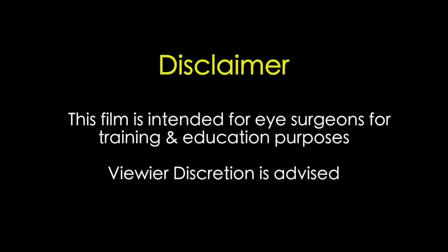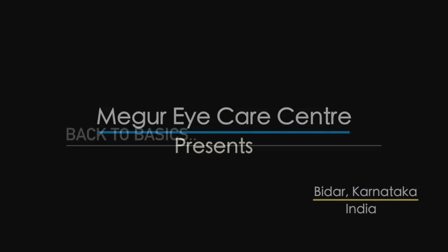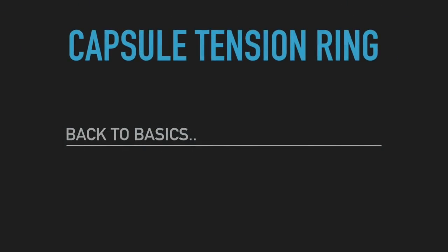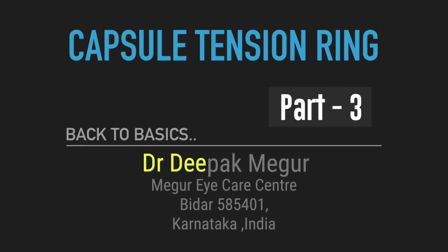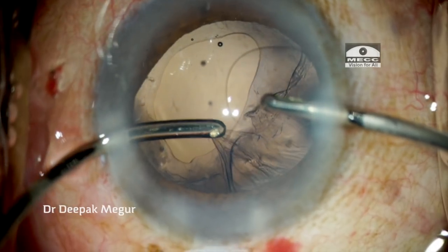This film is intended for eye surgeons for training and education purposes. Now moving on to situations where we are introducing the CTR after the emulsification of the nucleus. Let us begin with this one case.